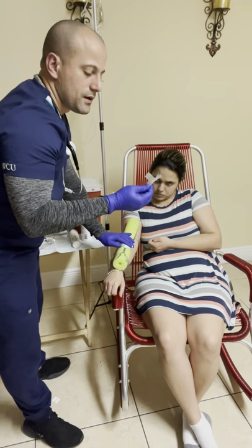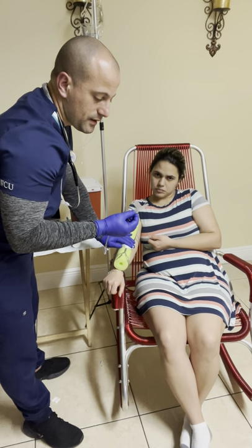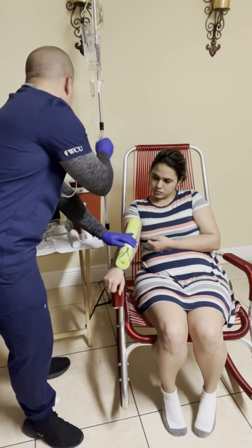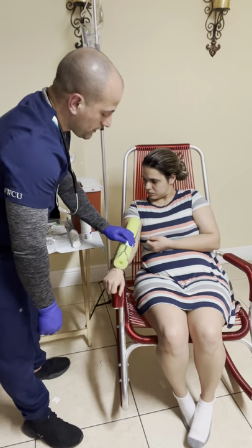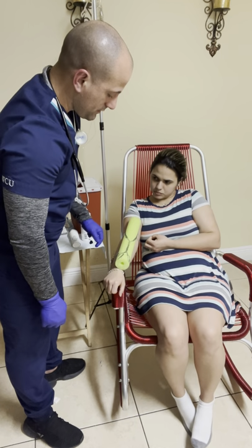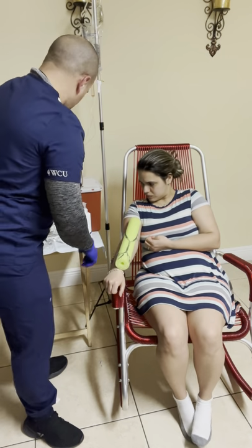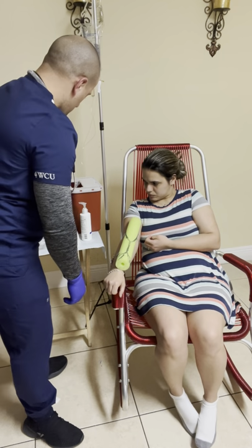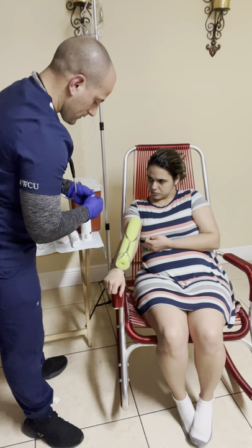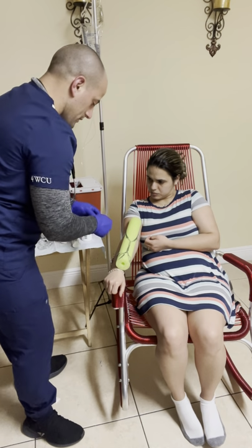I'm going to discard the catheter, and I have to check if the catheter is entire. Everything looks fine. I have to check if the patient is not bleeding. Also, I have to assess the skin for redness, rash. No bleeding, so I'm going to place a bandage on the patient.